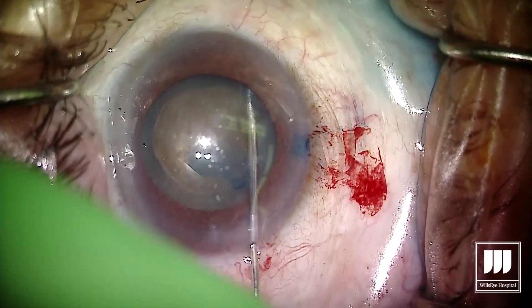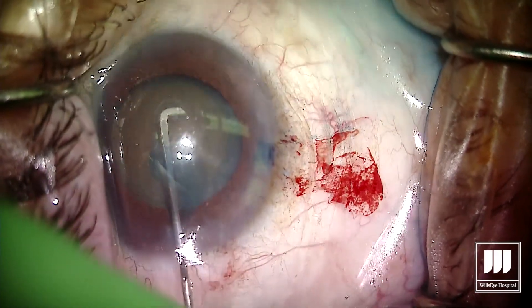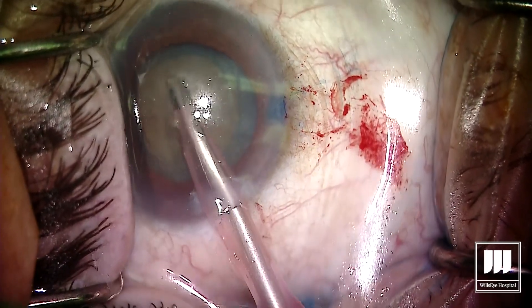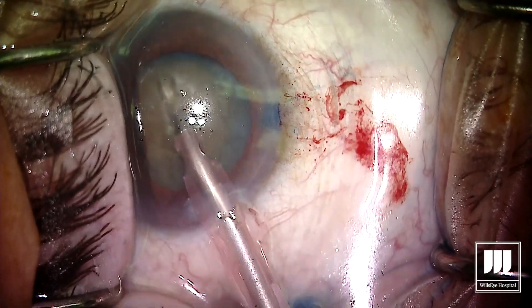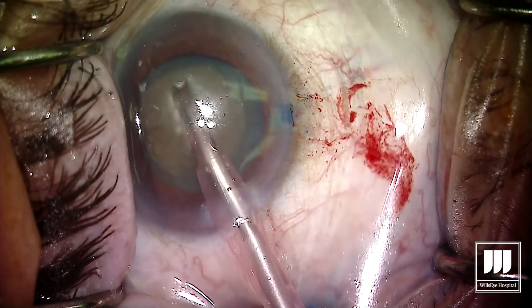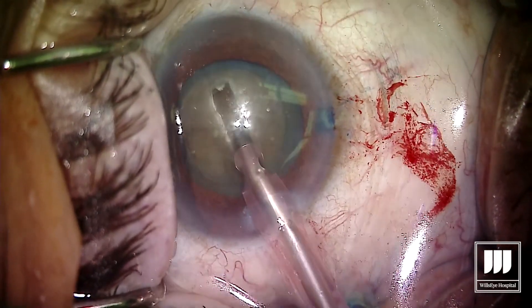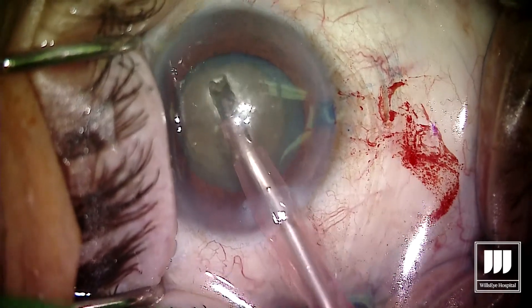Here you can see we've got a decent capsulorhexis and we're going to do our usual hydrodissection. Typically these lenses move pretty well. Now what we're going to do is start by using phaco with a more aggressive sculpt setting, trying to sculpt into the middle of the lens.